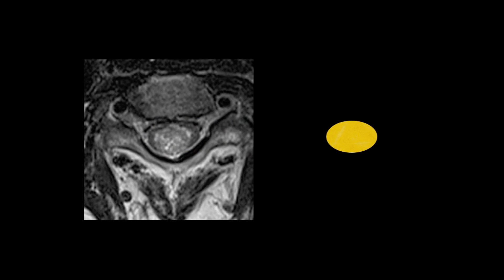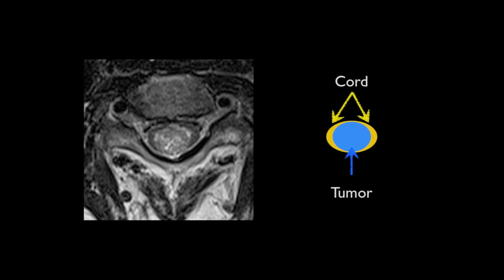As ependymomas arise from the central canal, it is not surprising that they are located centrally within the cord and expand it outward. One can readily see the relatively normal cord having been pushed to the periphery by a central high T2 signal heterogeneous mass, which represents the tumour.